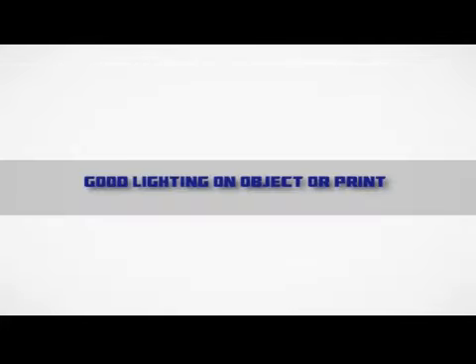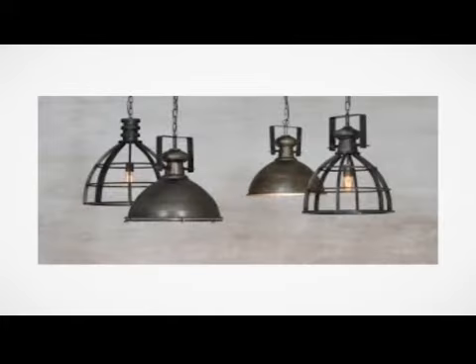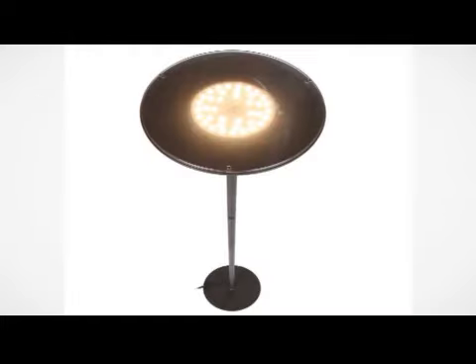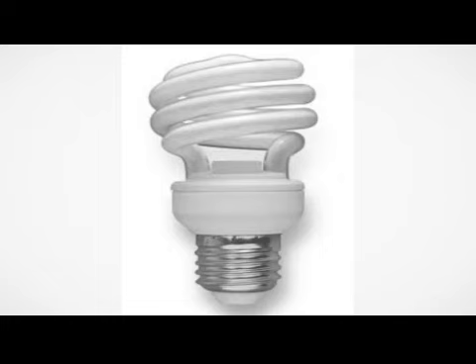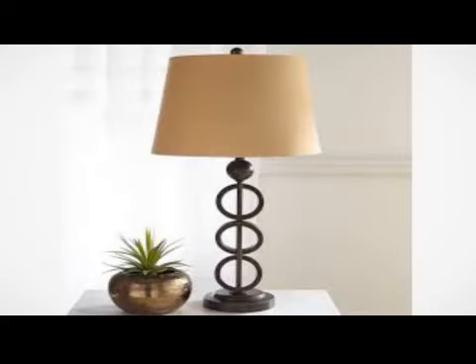Good lighting on object or print. Lamps and lighting are often the key to improved reading. However, what works is very individual. Some students find reading is easiest with very bright directional light illuminating the page. Other students with an identical eye condition, however, prefer low levels of diffused light. Students often prefer fluorescent lights. Table lamps are helpful for more lighting while reading.